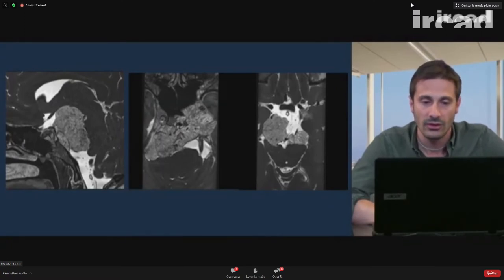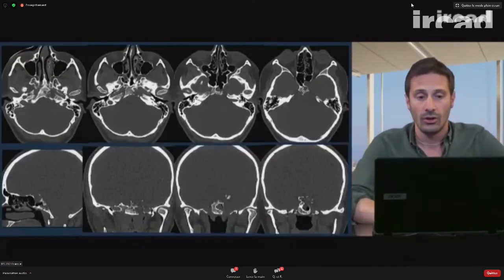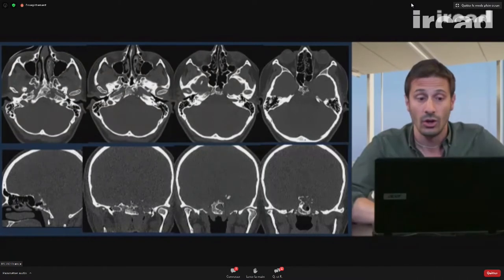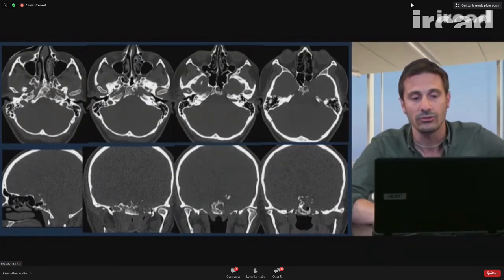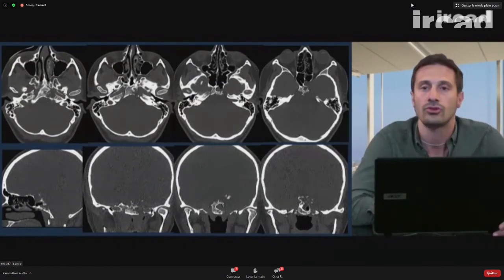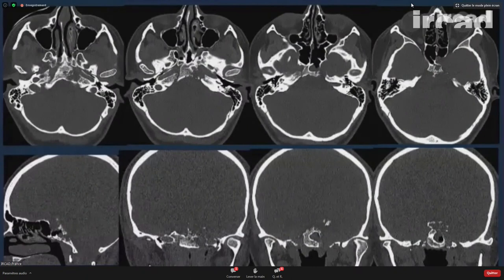As you can see here, there is an adherence maybe with the cerebellar peduncle on the right side, but there's a huge lateral extension on the left side in Meckel's cave and the cavernous sinus. The last image important to look at is always the CT scan for this kind of lesion. You can see the petrous apex on the left side is involved. We have erosion on the left side of the petrous apex, very close to the carotid. You can see the ICA close to the Dorello's canal, and you can see there is also some hyperostotic portion of the tumor with some intra-lesion calcification. The clivus is eroded, as you can see here in the sagittal images, and also the base here of the middle fossa is eroded.